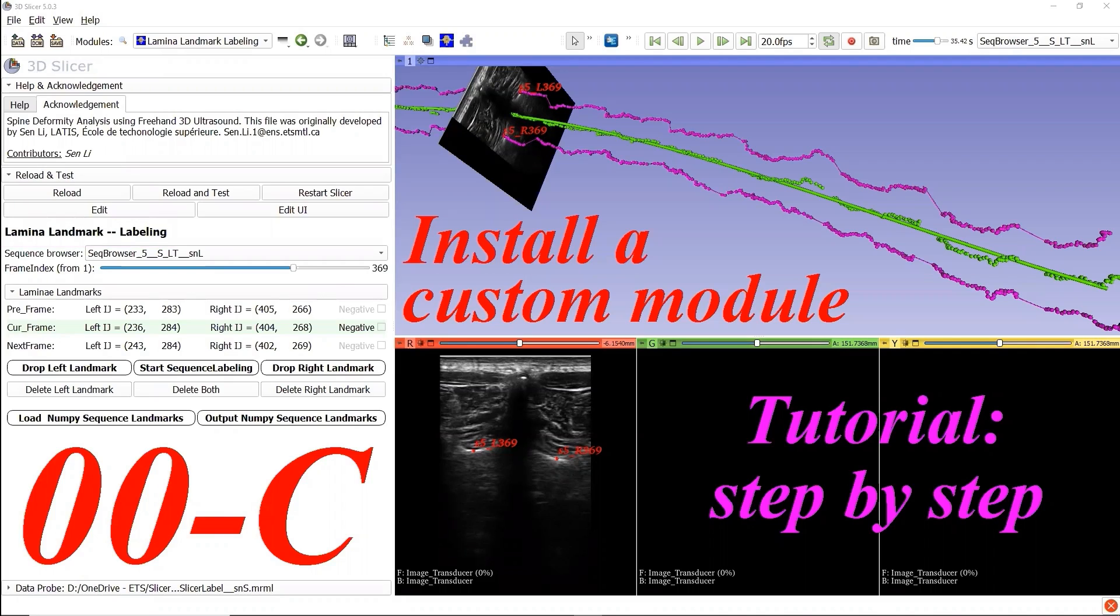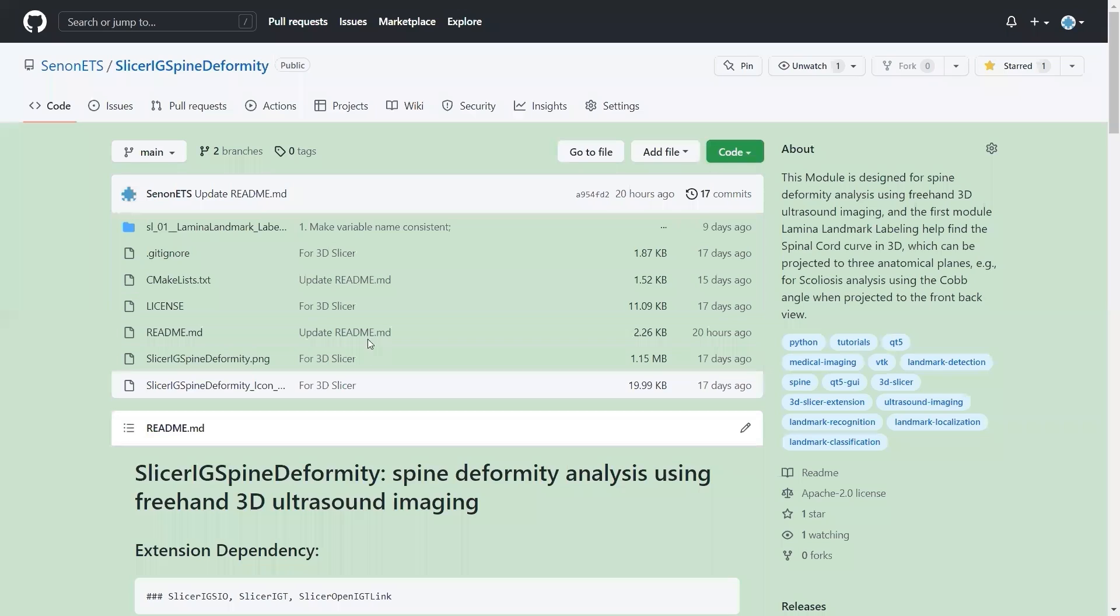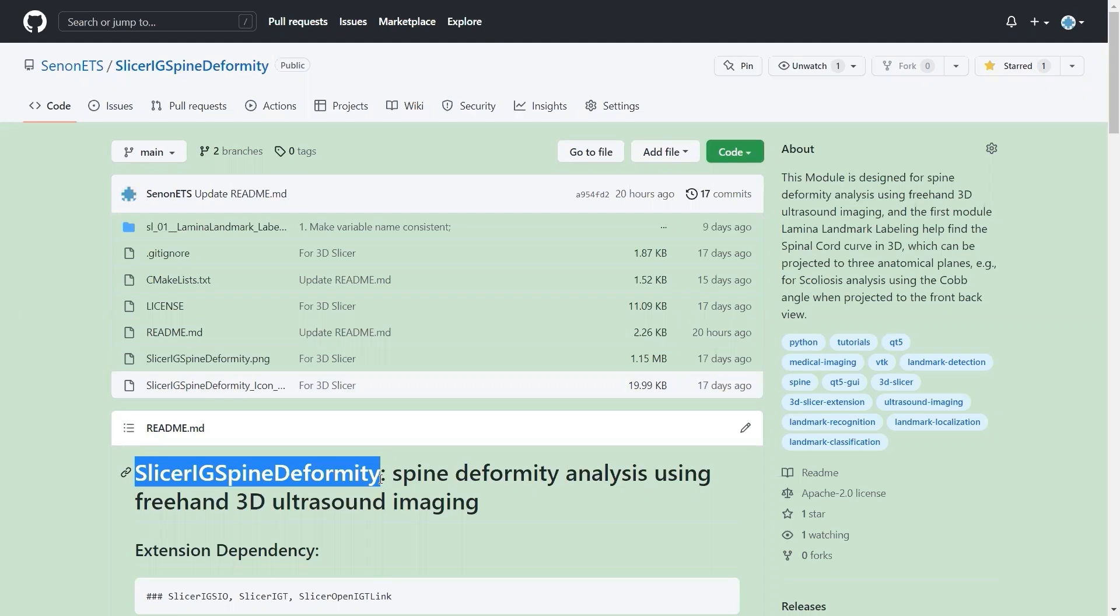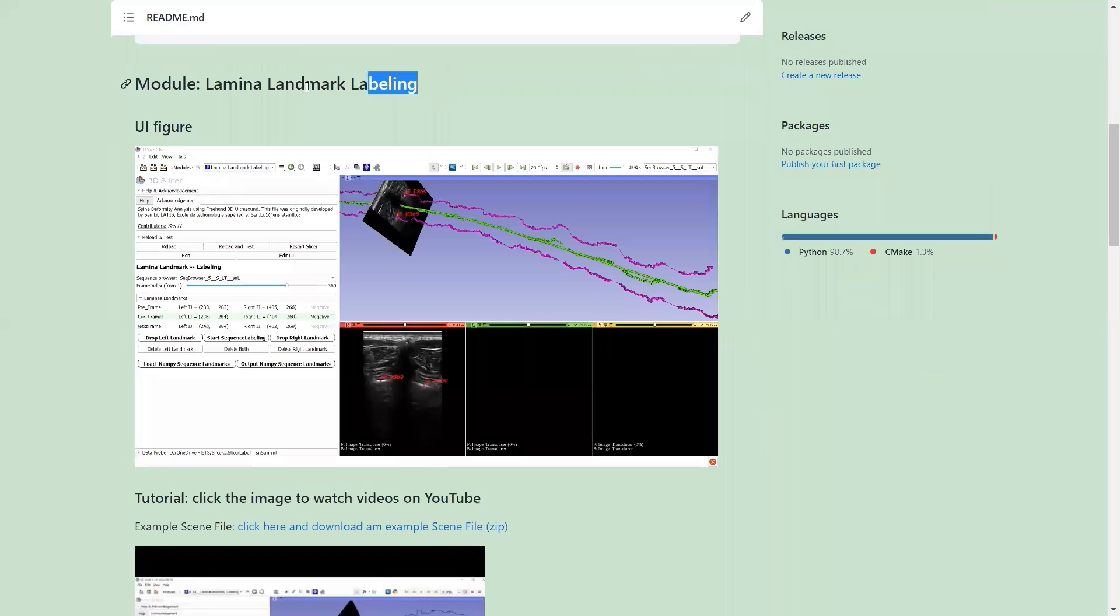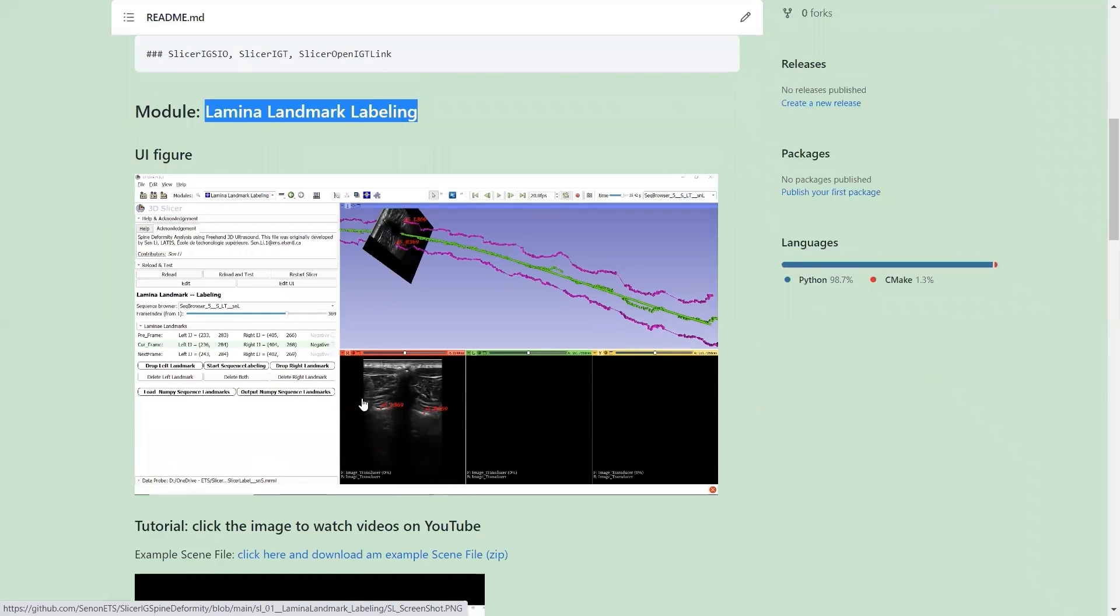From the video description, you can find the link to the GitHub repository of the 3D Slicer extension SlicerIGSpineDeformity. The module Lamina Landmark Labeling is one of the modules in this extension.